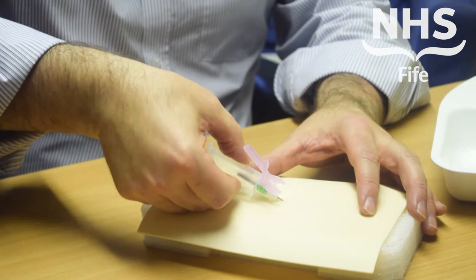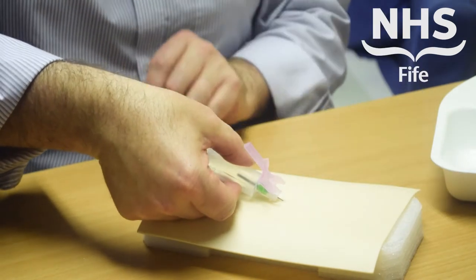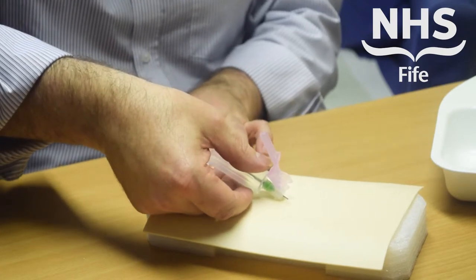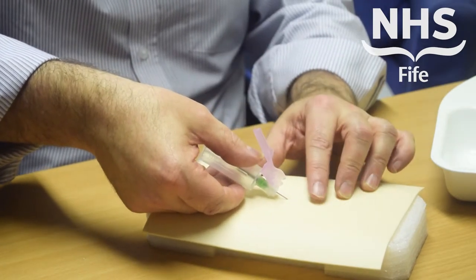Insert the device into the patient and take your bloods as you would do normally. Once you're finished with the device, remove it carefully.